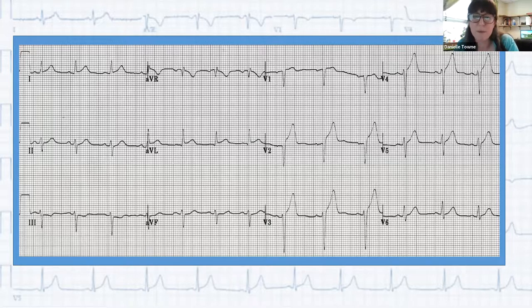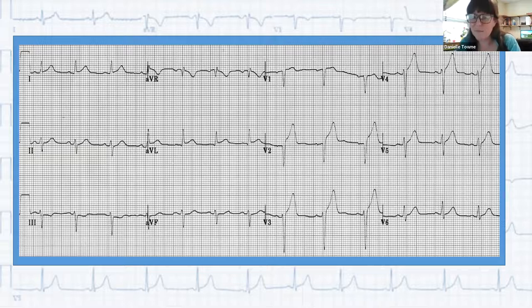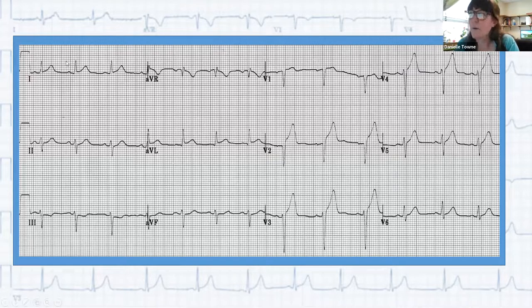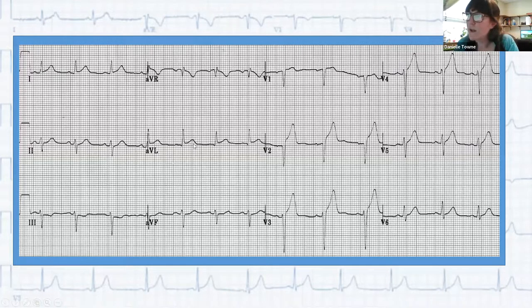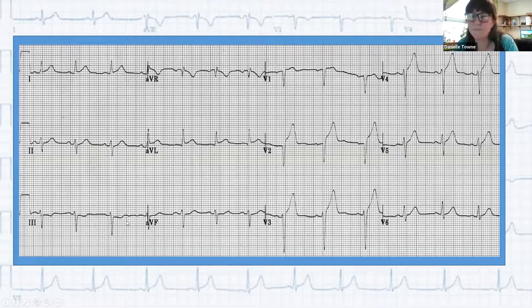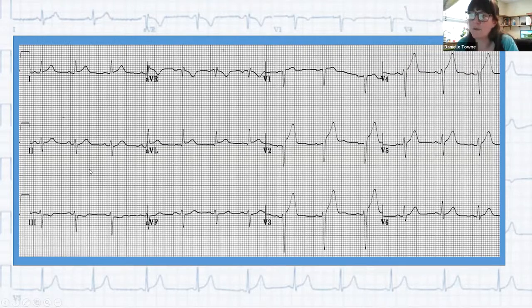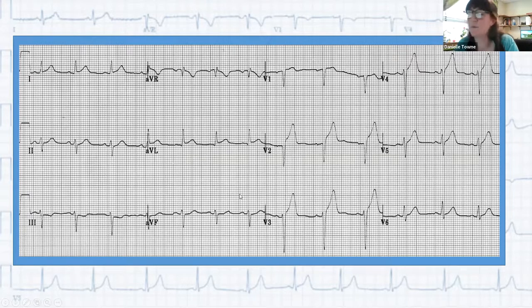In the second EKG example: rate appears to be about 70, P waves present, narrow QRS complex, normal PR interval — looking good. Decent R wave progression. No axis deviation on leads 1 and 2. Then checking elevations: ST elevations in V2 and V3, also elevations in V1 and AVL, and T wave inversions in the inferior leads. That means elevations in the anterior and high lateral regions with reciprocal changes in the inferior region — a large anterior MI. The vessel involved in anterior MIs is almost always the LAD.